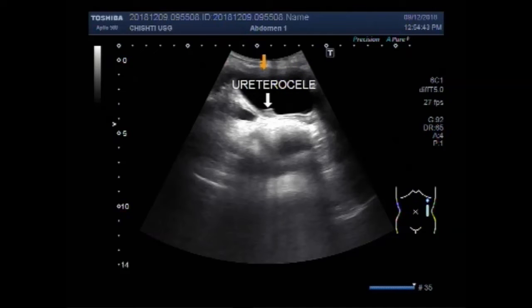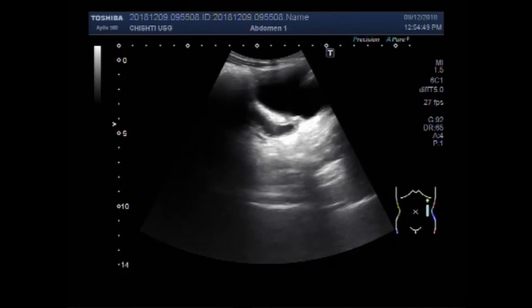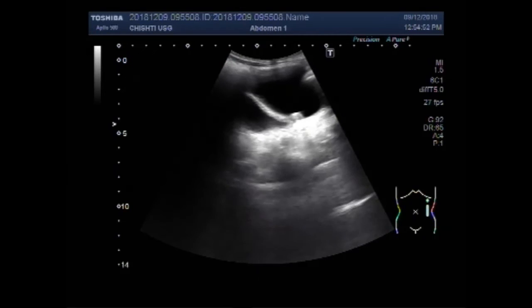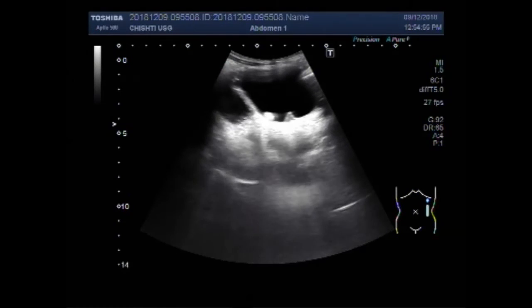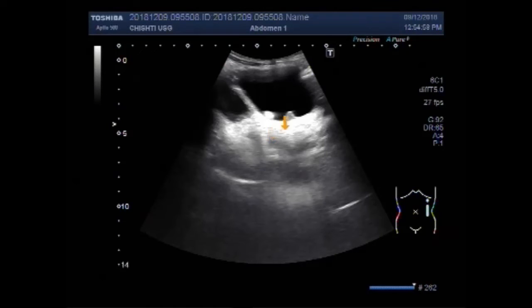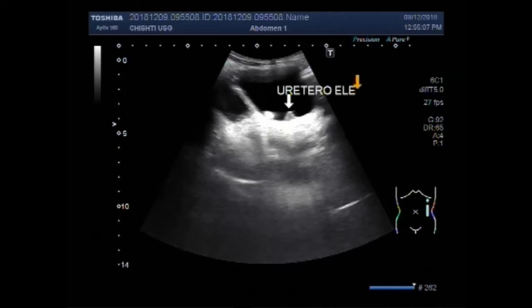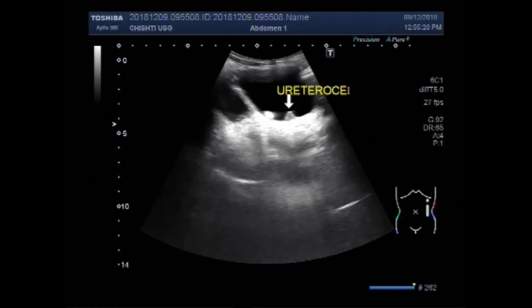And this is the ureterocele, seen from multiple views.